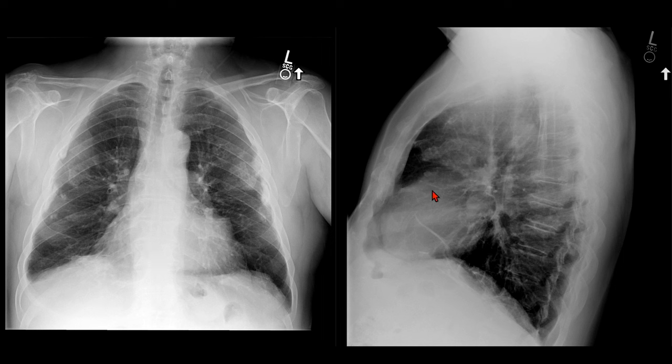On the lateral view, we see these angular structures in the retrosternal clear space and linear high-density along the diaphragm.